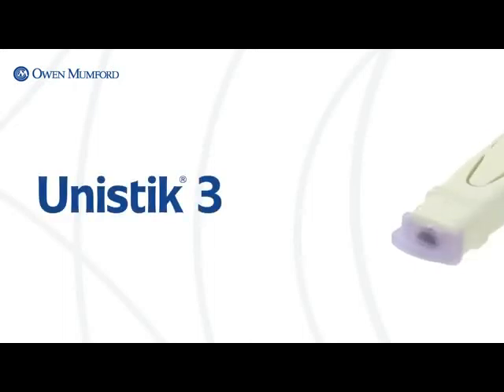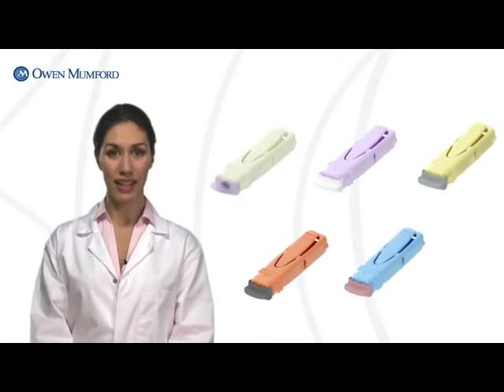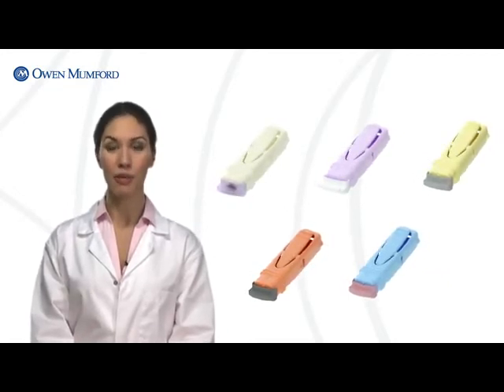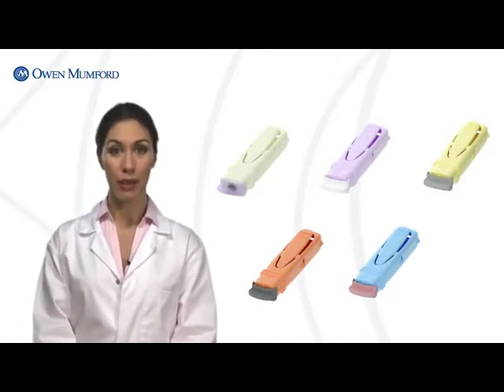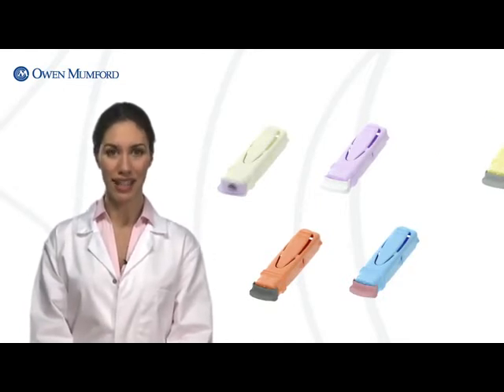Capillary testing shouldn't have to hurt. That's why Owen Mumford created Unistik3 single-use safety lancets. Unistik3 safety lancets are the only lancets featuring Owen Mumford's patented comfort zone technology for a virtually pain-free sampling experience. From haemoglobin and blood gas to cholesterol and glucose testing, this family of safety lancets offers a broad range of sizes to meet every capillary testing need.